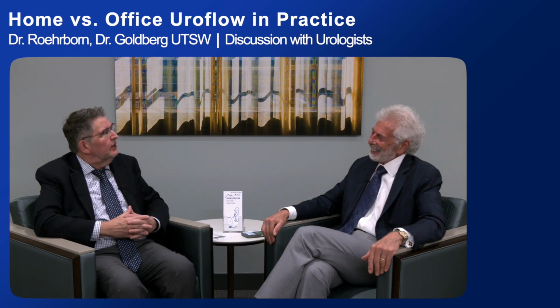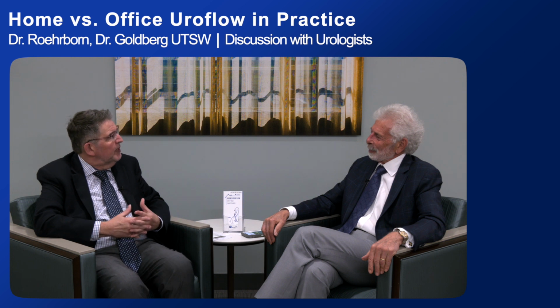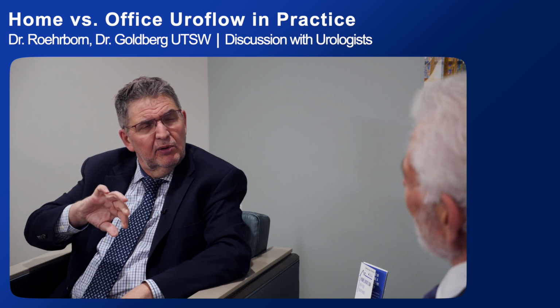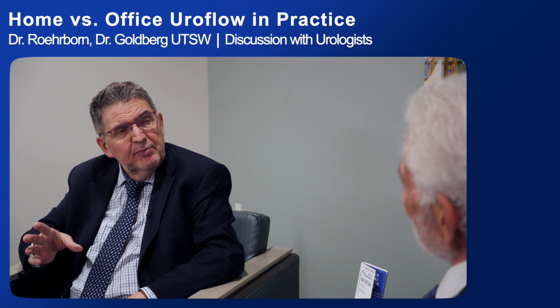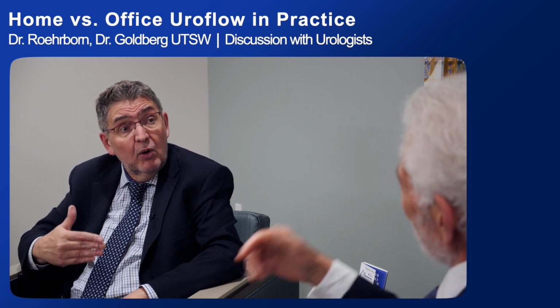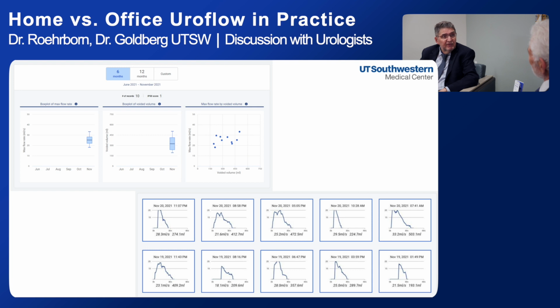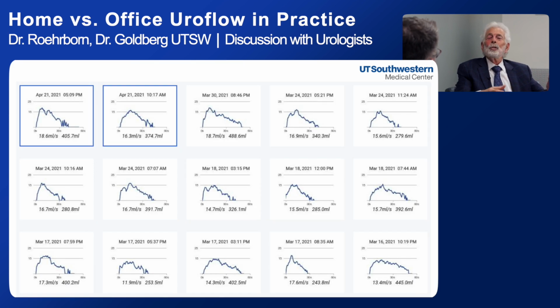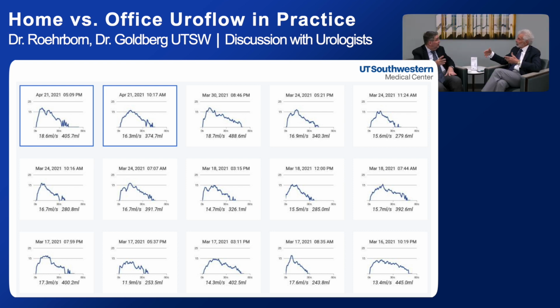But in any case, let's look at a few examples. You told me before that it's kind of remarkable. Many patients urinate over and over and over, and it's like a fingerprint. The flow rate curve looks very similar. I think you had one patient who always has a very strong flow rate, always a similar volume of 350 milliliters. I think we're looking at an example like that here, right? It is, and you have those type of patients, and you have other patients who consistently void either small volumes or consistently void with low flow rates, like the patient we're looking at here.